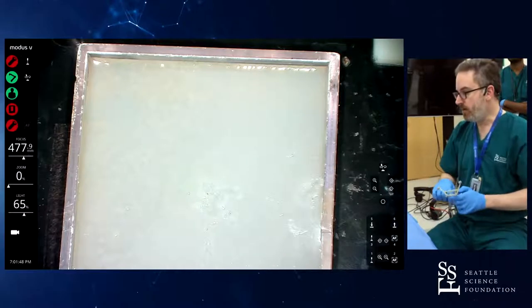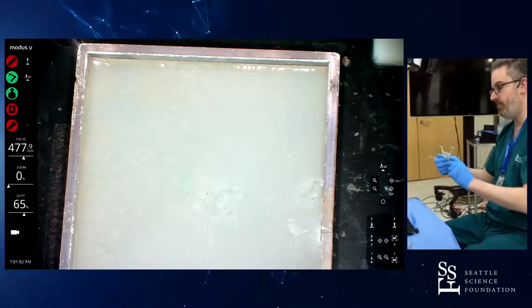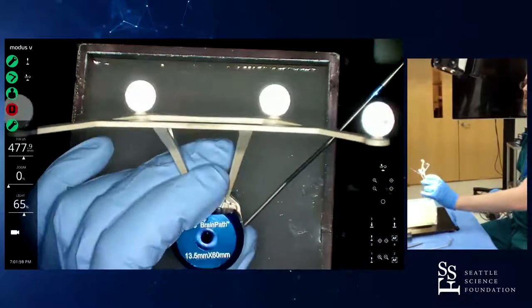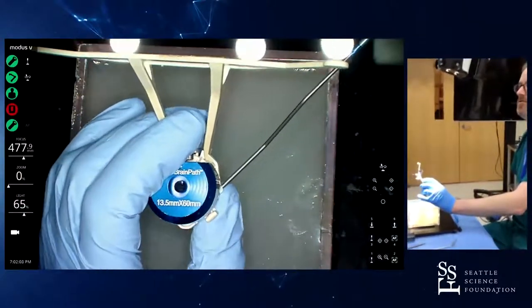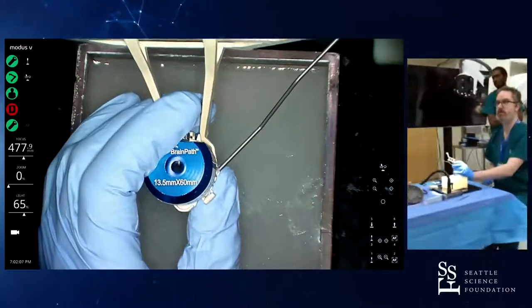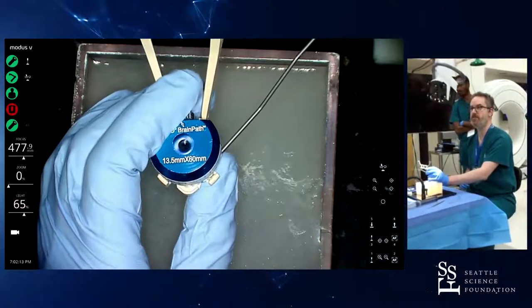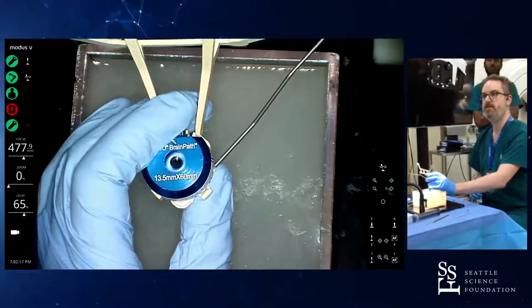For the purposes of this demo I'm going to freehand it, and I'll be set up to retract if I need to. This is no different than trying to line up a trajectory for doing a biopsy. What I'm looking at right now is the upper left corner, which is giving me a trajectory view, and you're just lining up your crosshairs.